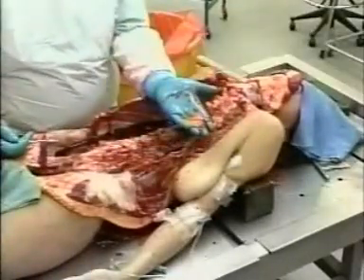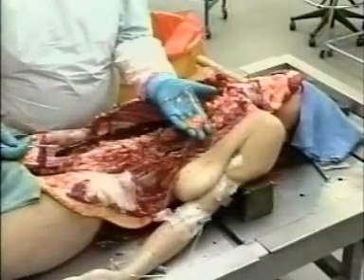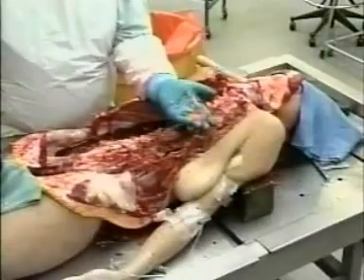That's an adrenal gland, which he's dissected off the top of one of the kidneys. Is that the left, Dave? Right. Right, yeah.